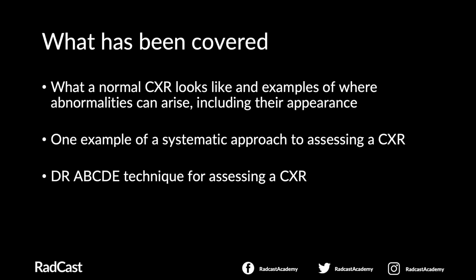To conclude, what has been covered in this presentation? We've seen what a normal chest X-ray looks like and given you examples where abnormalities can arise, including their appearances. We've looked through and discussed an example of using a systematic approach to assessing a chest X-ray, in this case, the Dr. ABCDE method.